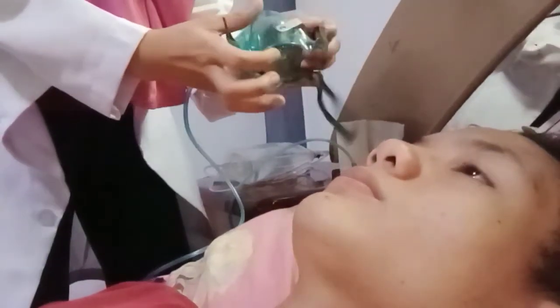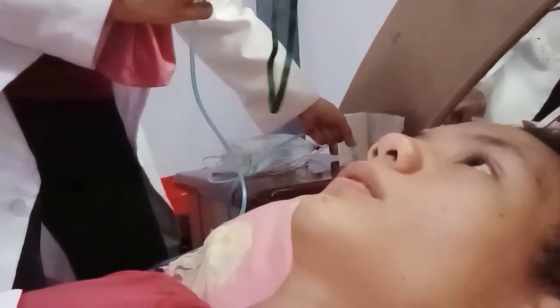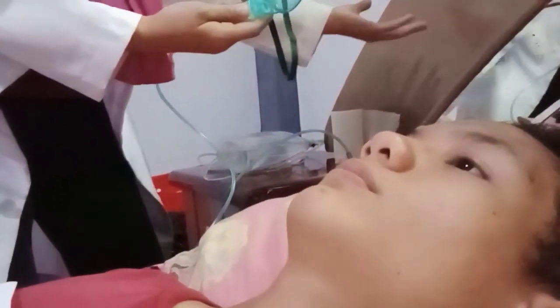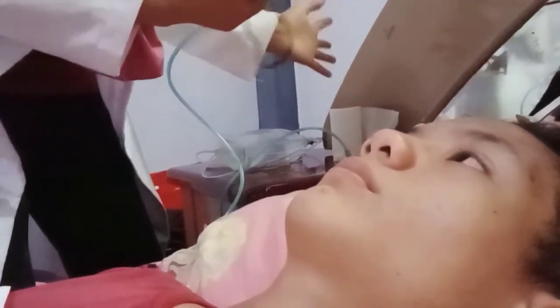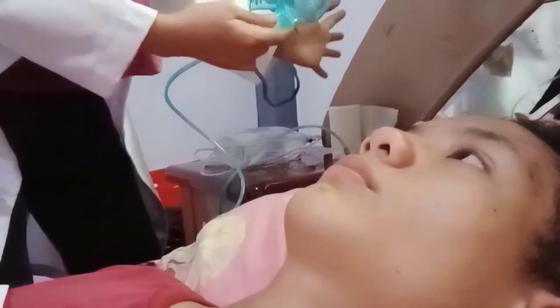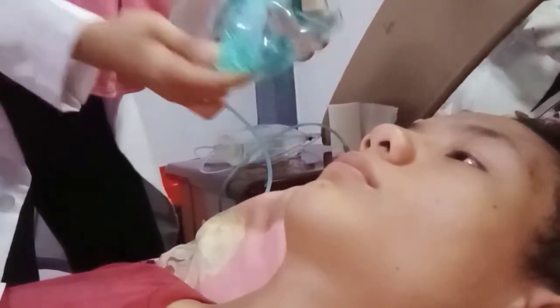Close the doors and curtains to ensure the patient's privacy. Oxygen is forced through the water reservoir and humidifier before delivery to the patient. This prevents dehydration of the mucous membrane. The reservoir bag must be inflated with oxygen because the bag is the oxygen supply source for the patient.